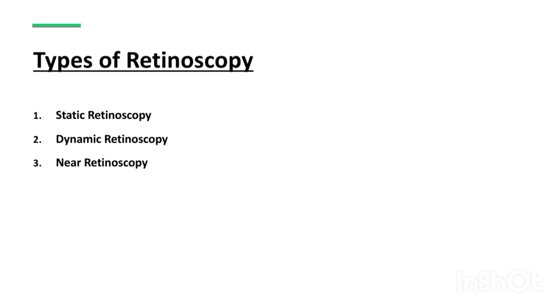Near retinoscopy is also a kind of static retinoscopy only, because by means of near retinoscopy also we are determining the refractive error or refractive power of the patient, but in a modified way. I will explain it later in detail. So let's move on. In this video we are focusing mainly on the concept of static retinoscopy.